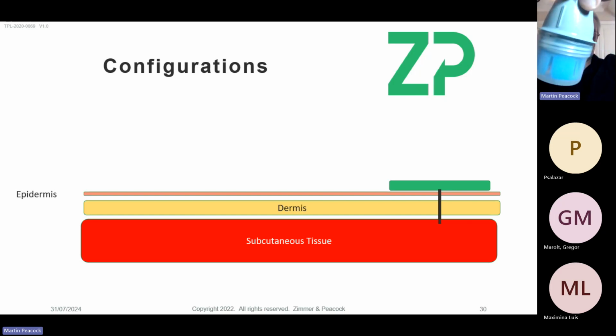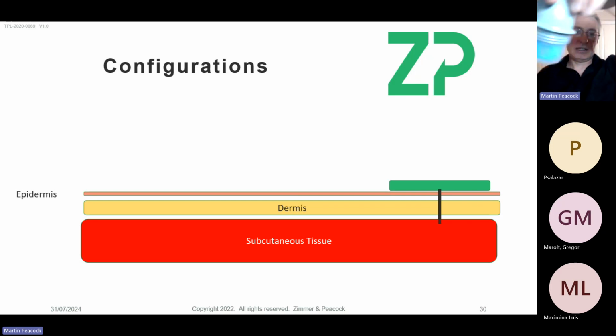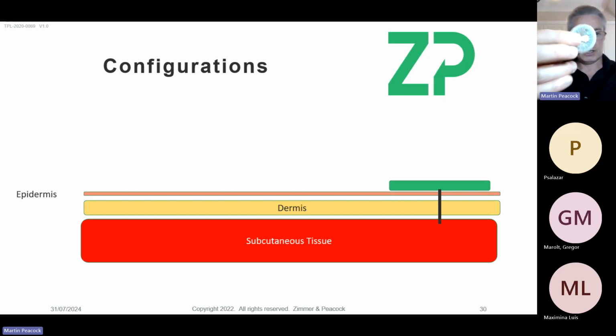The applicator is quite a large amount of material. There's a real spring in this. And this spring fires and essentially plunges the filament. They call it a filament. You could call it a wire. But this is probably carbon fiber, I suspect. They fire that through the skin, and it's left essentially behind.